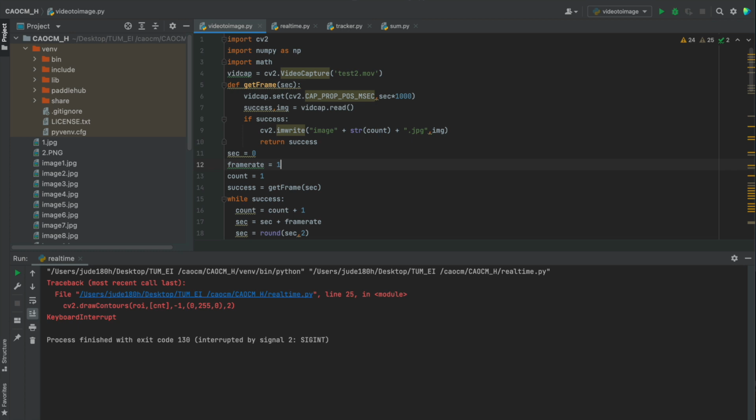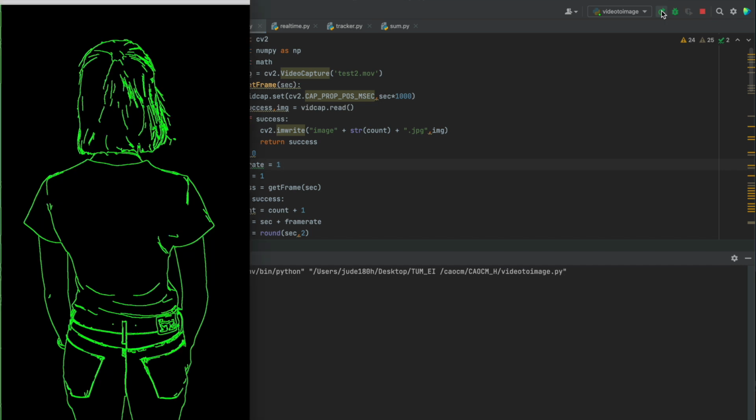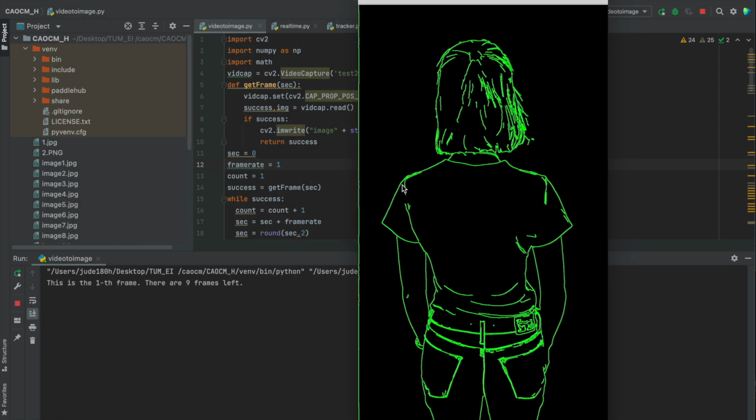We provide two alternative extension functions as substitutions. The idea of the first variant is only calculating the thoracic COBB angle in a static way. We first extract frames from the video and save them as images. The extraction rate is 1 frame per second. We next present the frame individually and ask the user to select the points by themselves.